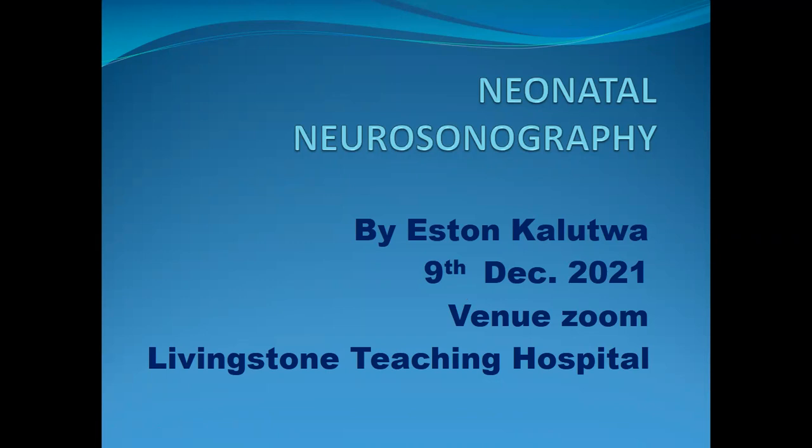Today, I'll talk about neonatal neurosonography. This is a very important tool, especially in neonates, because in every 10 live births, at least one birth is premature.